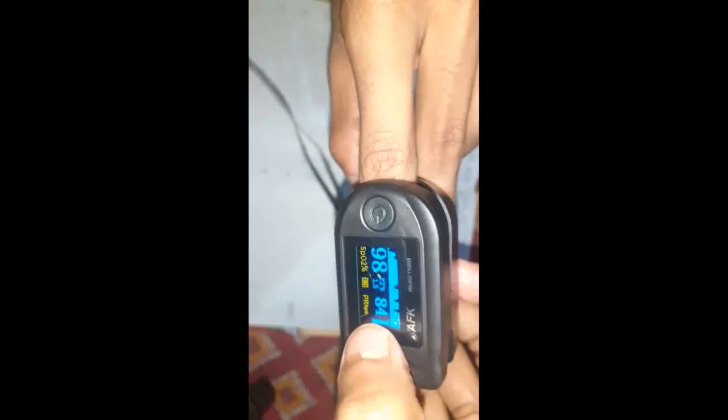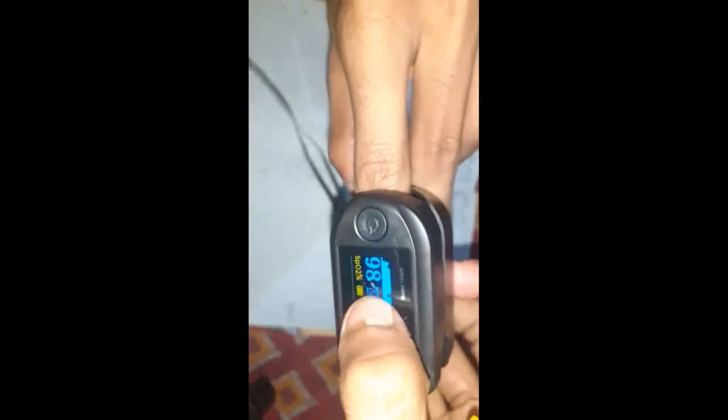My oxygen level is 98, my pulse rate is 84, and my PI is 1.8.